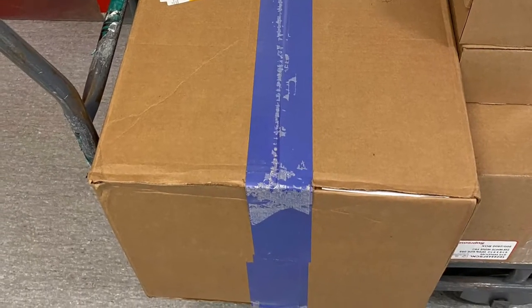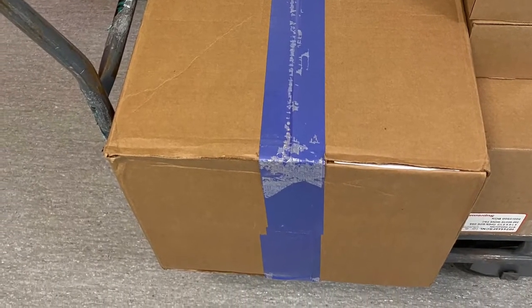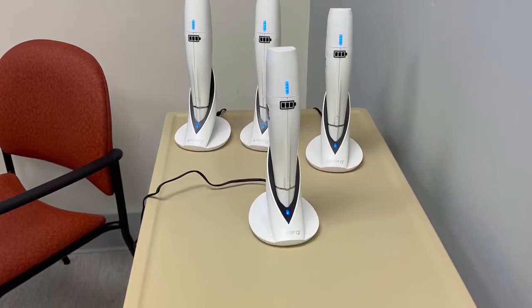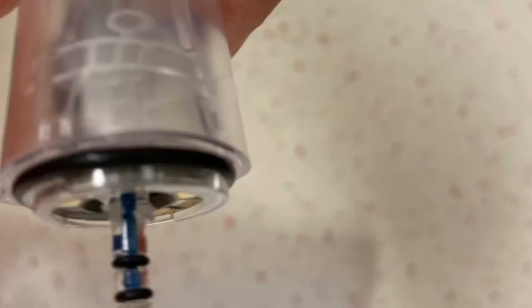I am beyond thrilled to receive my new cryoneurotomy equipment as part of our clinical trial. This is the iOVERA system made by Passera. We are doing an upper and lower extremity study. Here are four handheld machines that have a charging dock, and here is the smart tip at the end. It is an individual probe calibrated for one procedure.